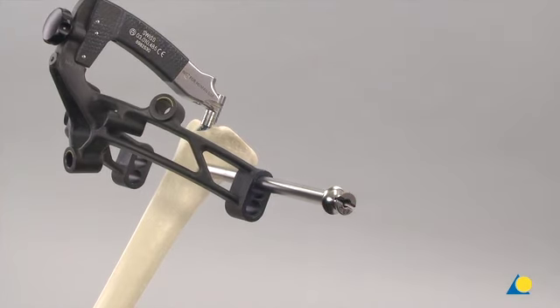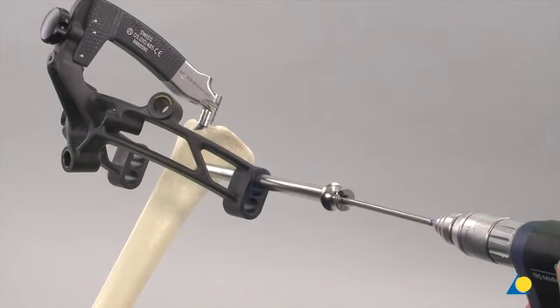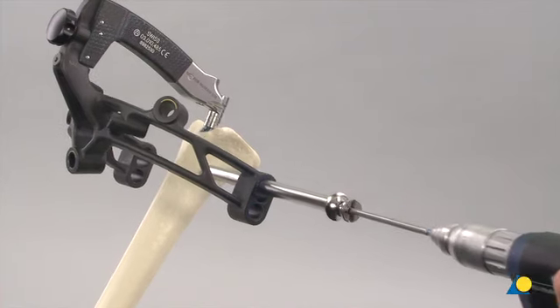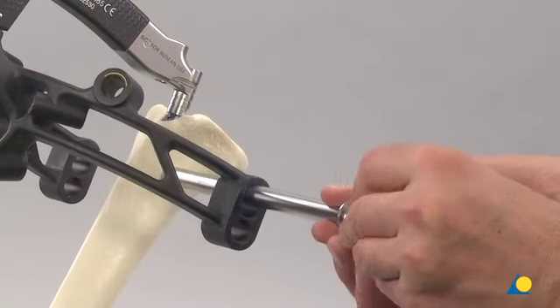While ensuring that the drill sleeve is pressed firmly to the near cortex, a 3.2 mm hole is drilled through both cortices until the drill bit just penetrates the far cortex. The position of the drill bit is confirmed with image intensification. The drill bit is withdrawn and the drill sleeve is removed.